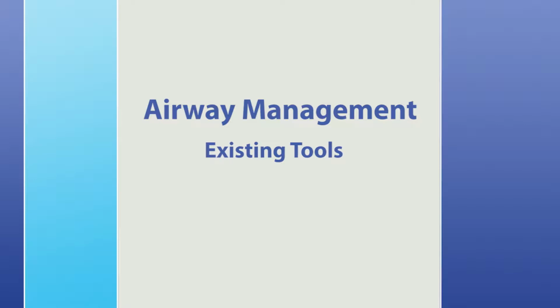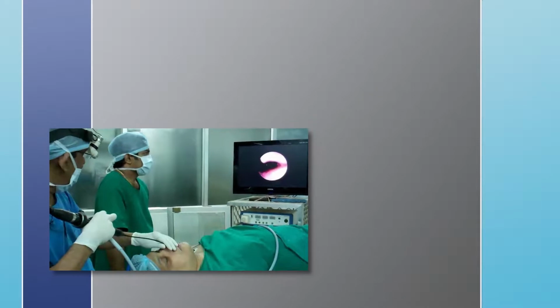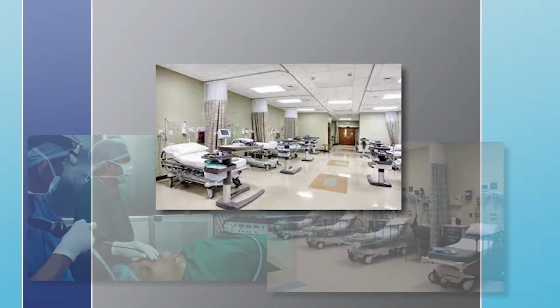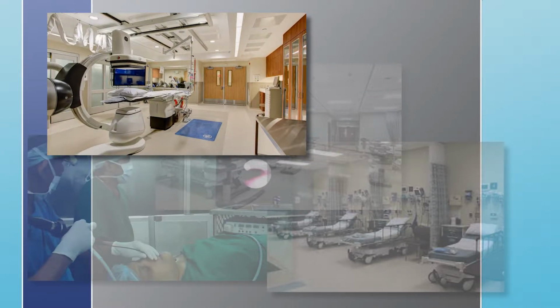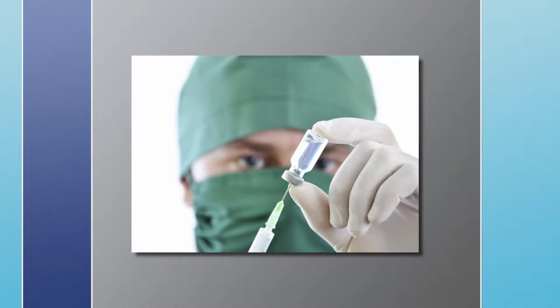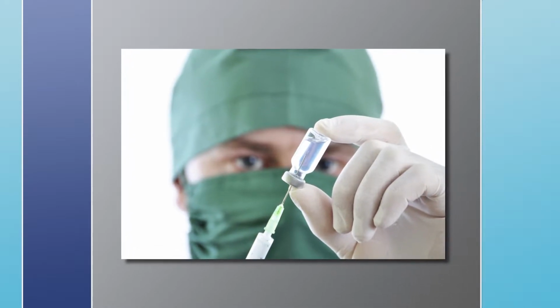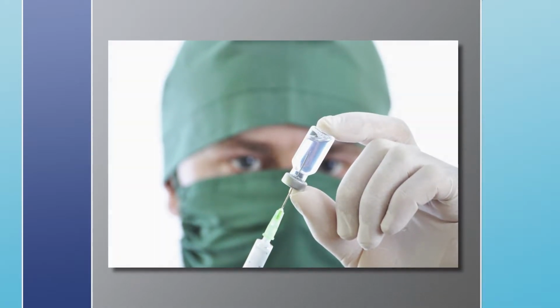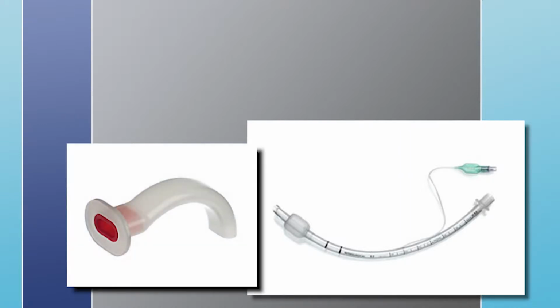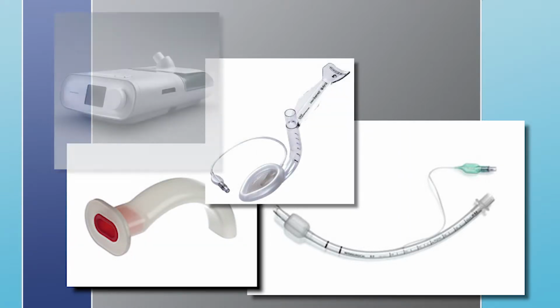Sedation-related airway compromise is a common challenge and problem for medical professionals in multiple environments, including sedation procedures, post-anesthesia care units, ambulatory surgery centers, GI, radiology, imaging studies, and other settings where airway compromise is common. Commonly used sedatives can lead to upper airway compromise by reducing tone in airway muscles, similar to what occurs in sleep apnea patients.